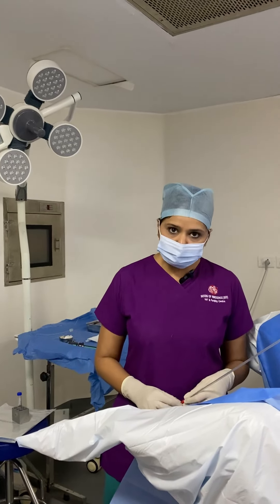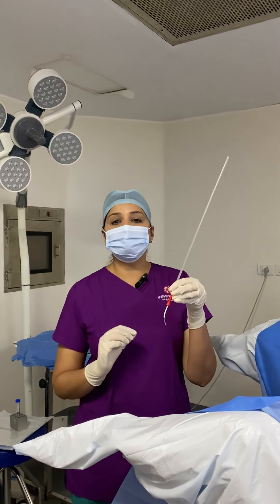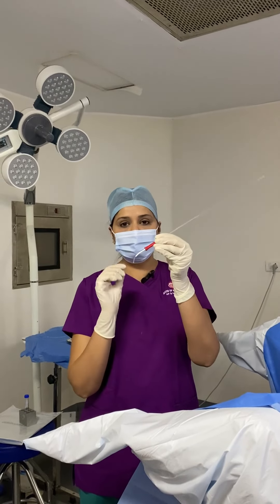We anesthetize the patient. The patient is anesthetized and this is how we prepare the ovum pick-up needle. We cut the tube of the needle and keep the needle ready.